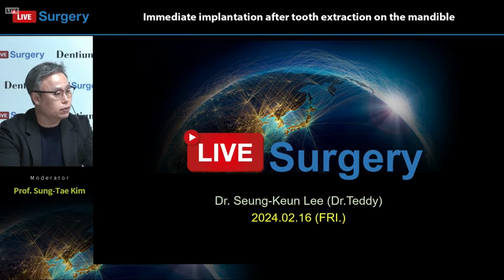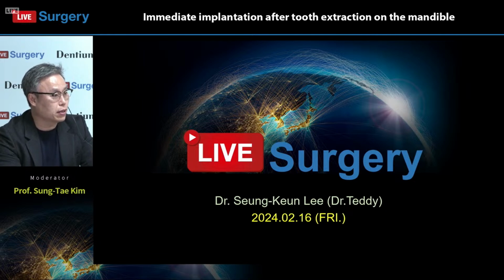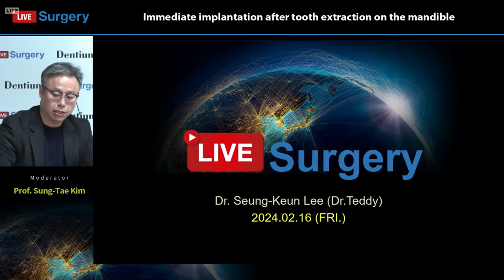So today we prepared a very interesting and valuable case. You can use it in your daily practice. Everybody knows Dr. Teddy Lee. He has been showing a lot of live surgery so far. Today's case is about posterior tooth extraction and immediate implant placement. I hope you enjoy it and get a lot of lessons from the live surgery. Let me start the surgery.